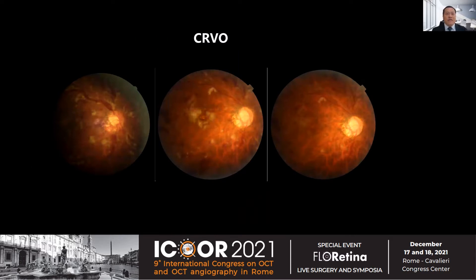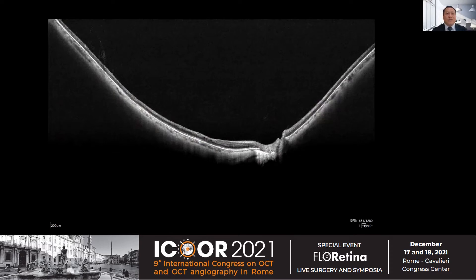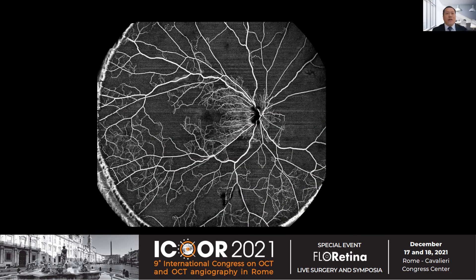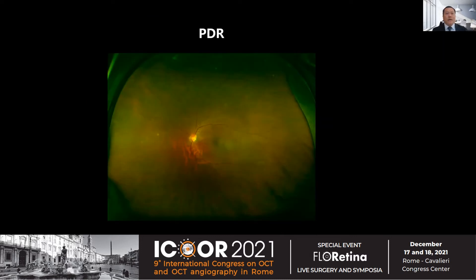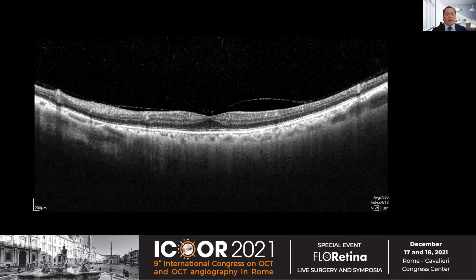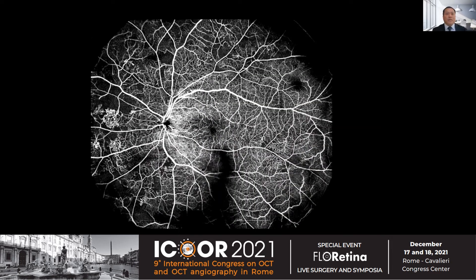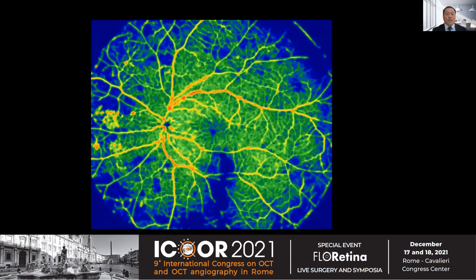This is a CRVO patient before and after anti-VEGF treatment. The 24-millimeter B-scan and 24-millimeter wide-field OCTA show a large non-perfusion area in every quadrant. Quantification can be done nicely. This is a PDR patient. The 24-millimeter OCTA shows many features of diabetic retinopathy with quantification.